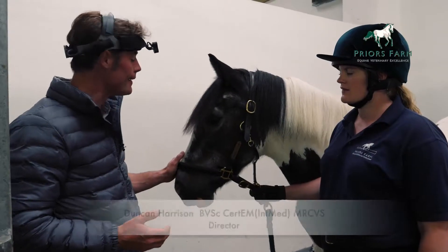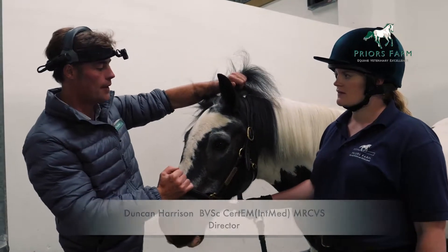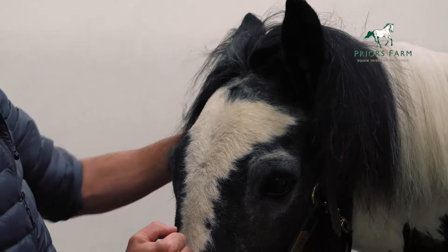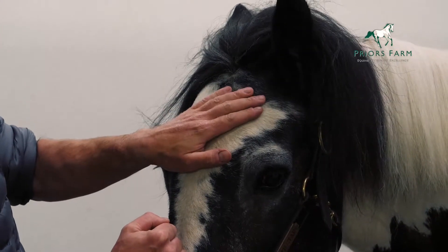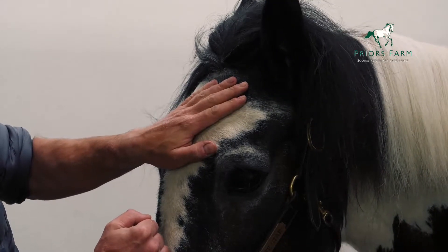This is a basic dental examination. First of all, look at the forehead. These are the two masseter muscles here. And if a horse has had severe problems for a long time, you can actually see that one side of the muscle can be larger than the other, because one side of the jaw has been working harder.